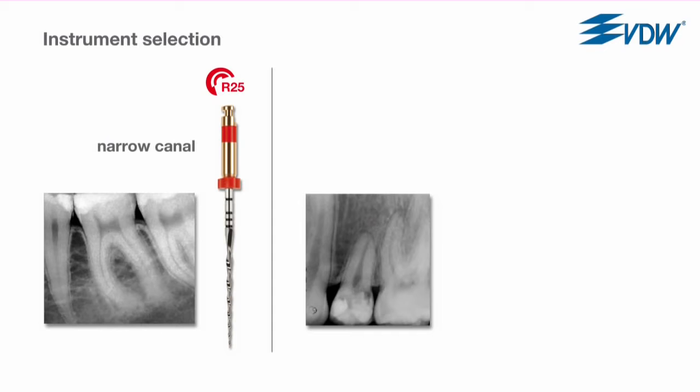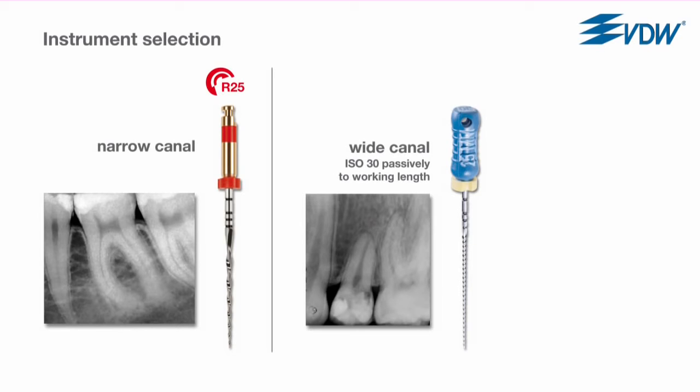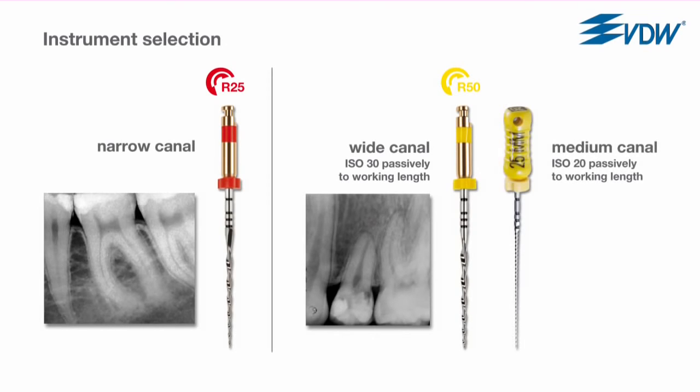In this case, take an ISO size 30 hand instrument, insert it passively into the canal. If it reaches working length, the canal is considered wide, and the R50 can be used. If an ISO size 30 hand file does not go passively to working length, repeat this step using an ISO size 20 hand instrument, and then prepare with R40.